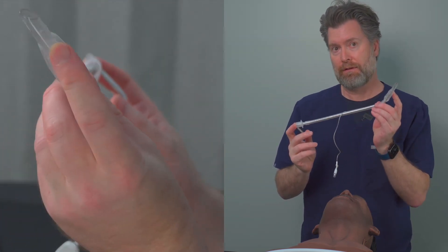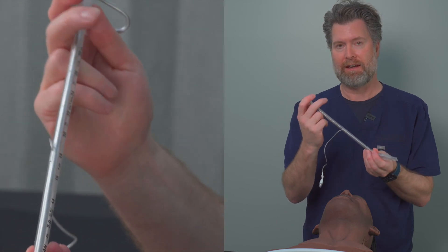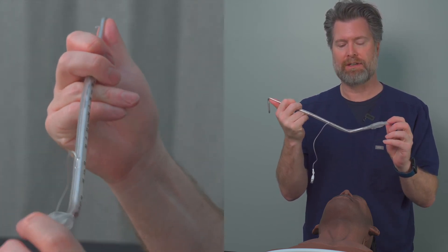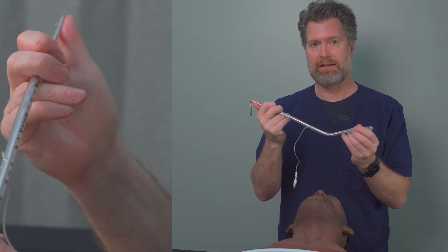Here's the end of the stylet. I'm going to take my hand, I'm going to pop, and what you can see now is this is really soft — and now you're not going to damage any structures when you advance into the trachea. So: stop, pop, and then advance.